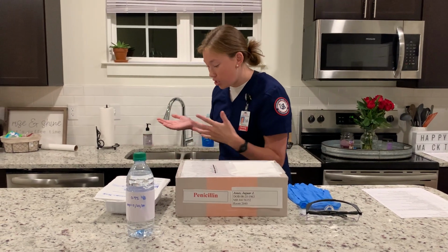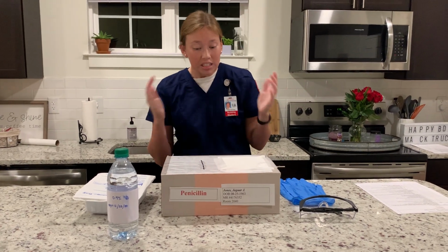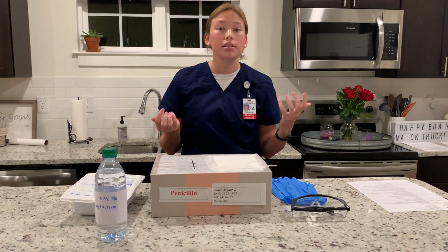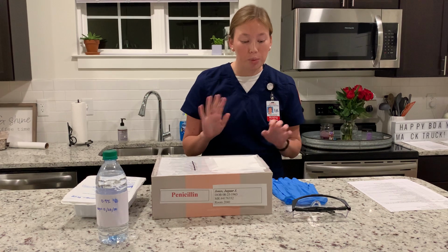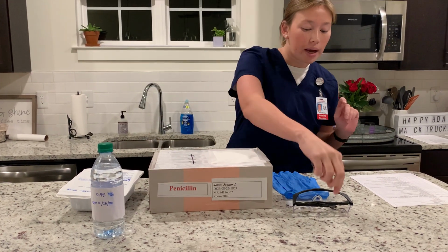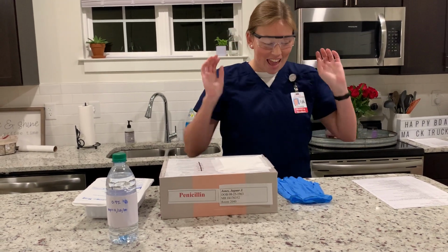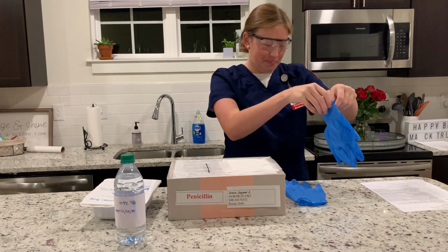I first will position my trash can wherever I will need it for the procedure, depending on how the room is, and then I would use antiseptic hand rub after that. Then I will raise the patient's bed to a working level, depending on my height. I will lower the side rails, and then I'll make sure the patient is comfortable and help them position it any way. So now I will put on my glasses or goggles, protective eyewear, and then I will put on my gloves.